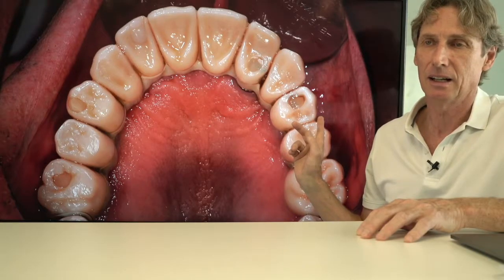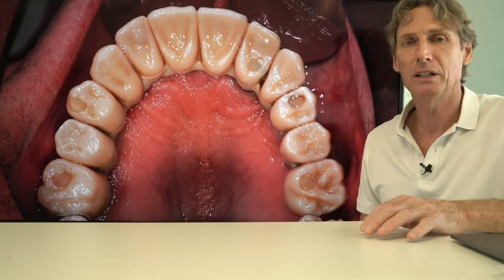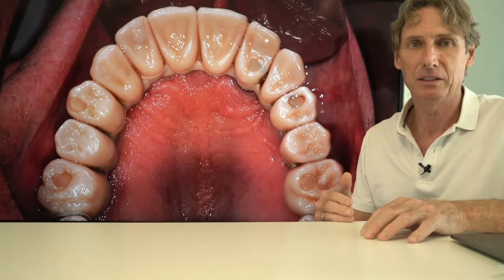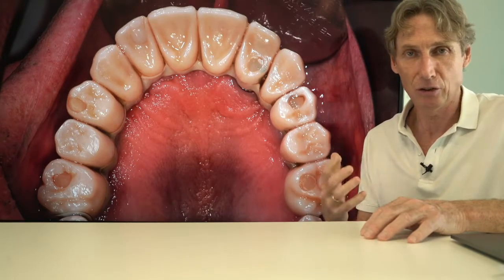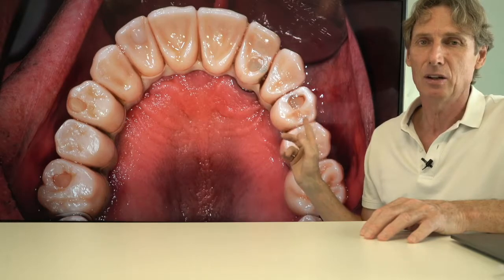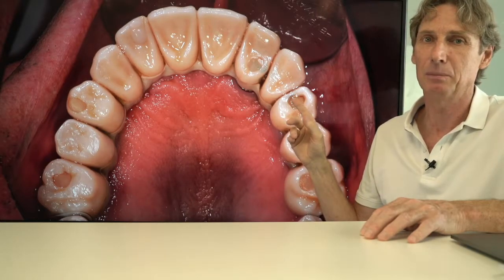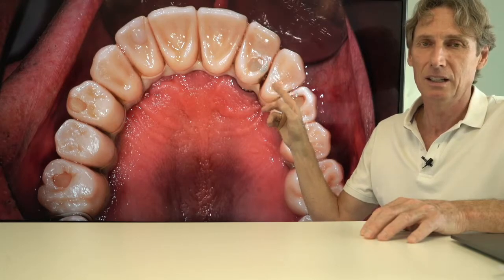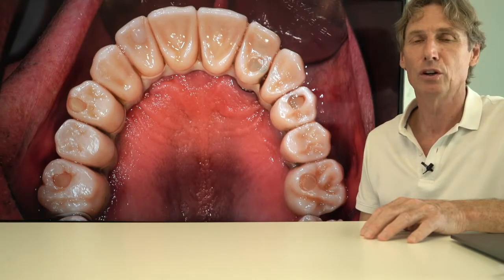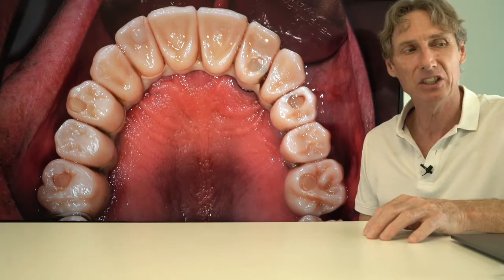Here you see a 4.5-year-old bridge work in the patient's mouth. Normally nobody likes to show treatment solutions that have already been several years in use, because it's normal that they don't look like new. But here on this patient, the only part where you can really see these 4.5 years is the brown coloring of the composite in the screw channels, and for the rest there's absolutely no deterioration. We have no fissures, we have no cracks, we have no abrasion.